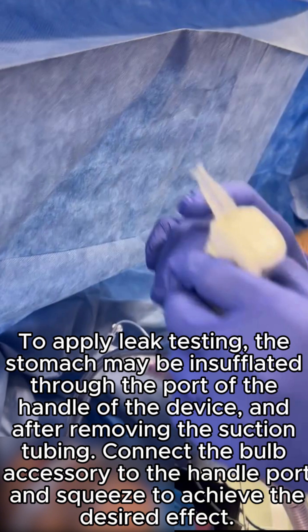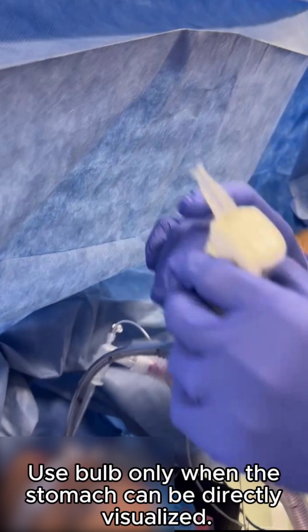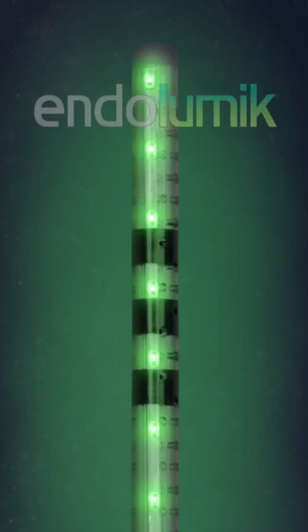To apply leak testing, the stomach may be insufflated through the port of the handle of the device after removing the suction tubing. Connect the bulb accessory to the handle port and squeeze to achieve the desired effect. Use the bulb only when the stomach can be directly visualized.